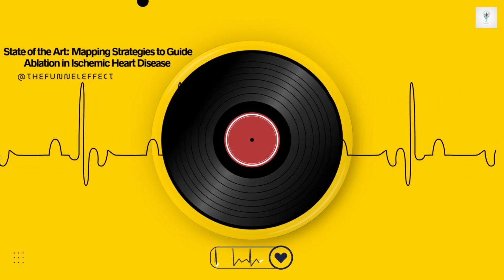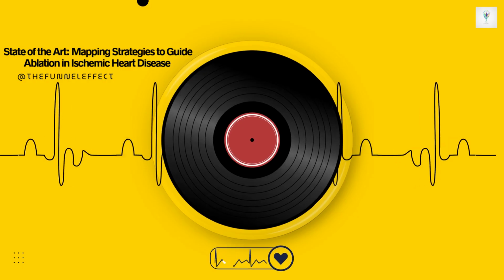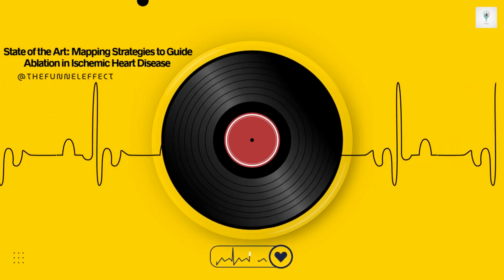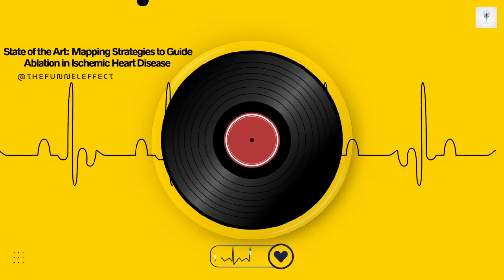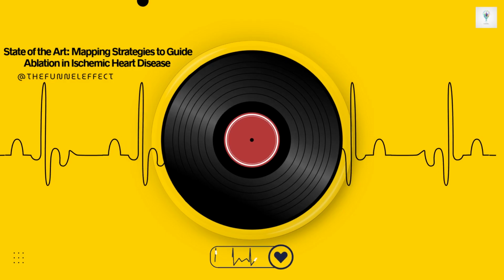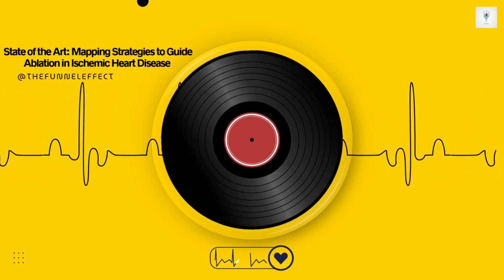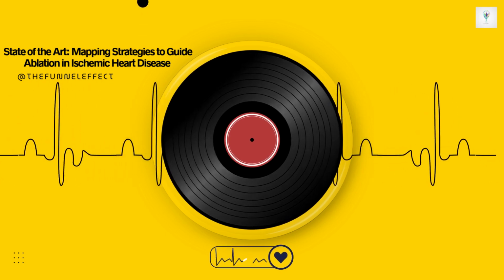On the other hand, for patients with smaller, maybe more patchy scars, perhaps with better overall heart function, the approach might be a bit different. They might start by just ablating the entire small, low-voltage zone. Then they might rely more heavily on functional mapping, EDPs, LAVs, to find any remaining critical slow conduction sites, often located in the border zones around that main scar, that need very precise ablation.